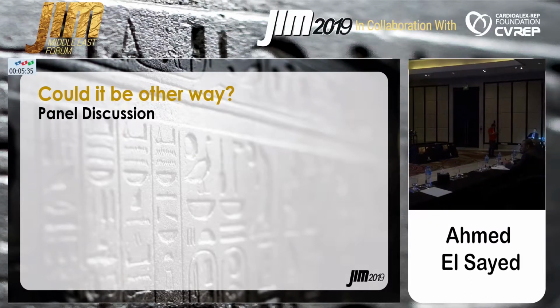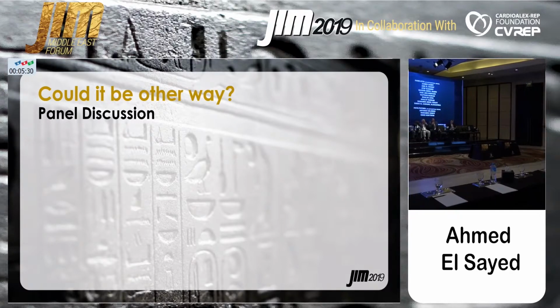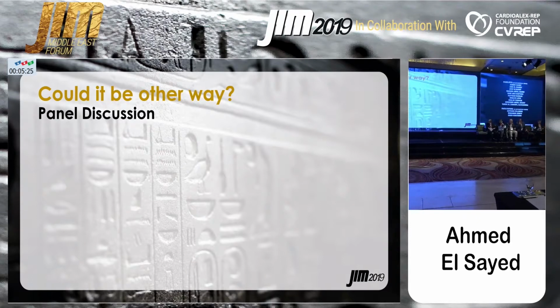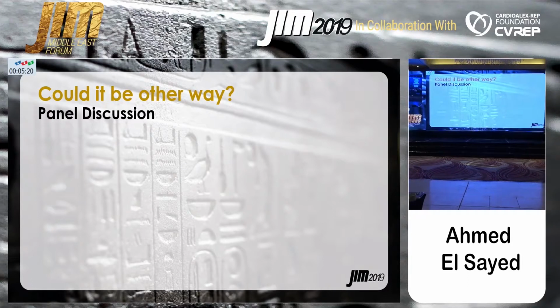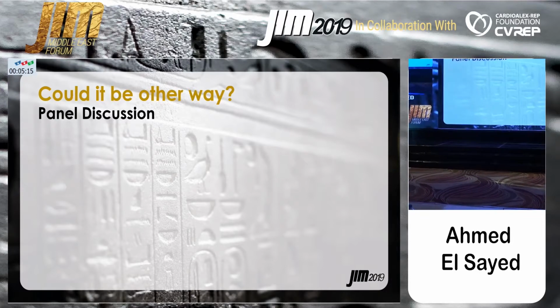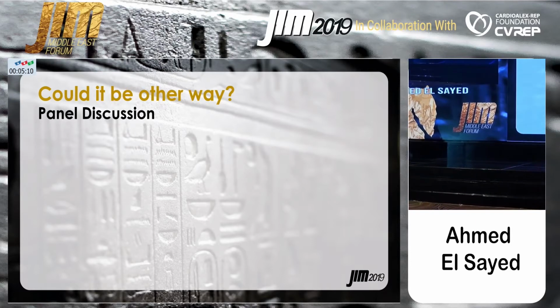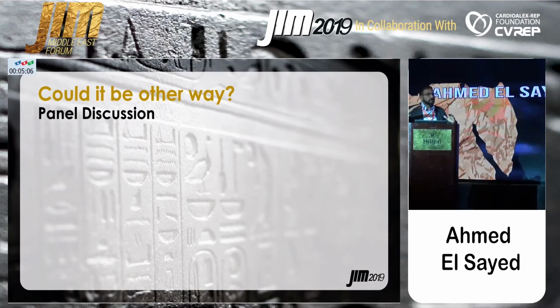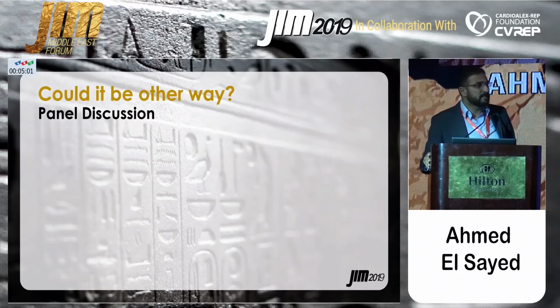So in case we suspected, during the balloon aortic valvuloplasty, that there was a risk of coronary occlusion with the displaced leaflet, we would even put a stent in the coronary at risk, to withdraw it after valve implantation in case there was a compromise of the ostium of the RCA. But in this case, the balloon aortic valvuloplasty showed that the ostium was patent even with the displaced leaflet, so we thought we didn't really need to leave it.